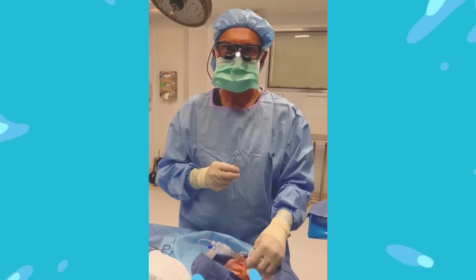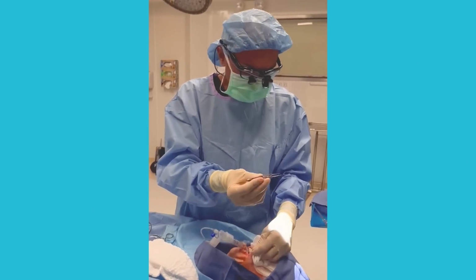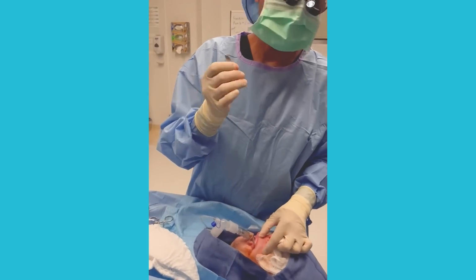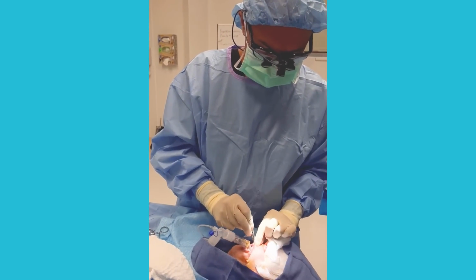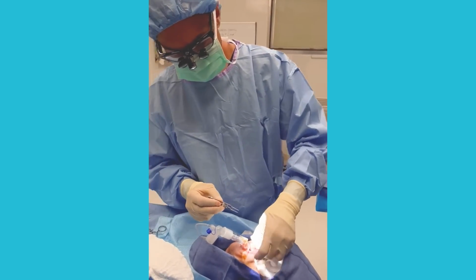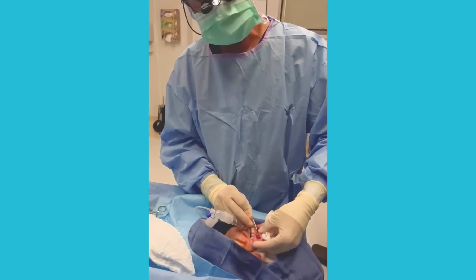Good. Okay, so let's go over the anatomy very quickly. So now here, this is where the cyst was. We know it wasn't a mucocele. It was a sebaceous cyst. We couldn't find the punctum anywhere, but when we went in, we found the attachment. So let's go from the inside here. When we look in there, this is your labial artery, and it's preserved.